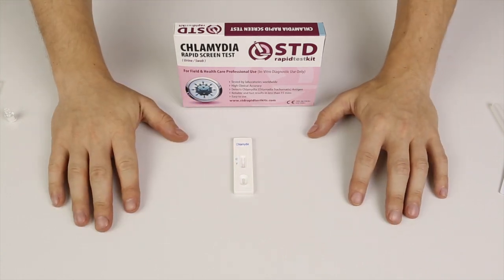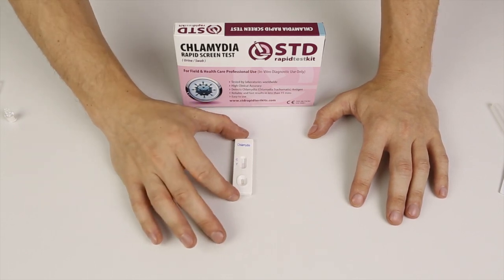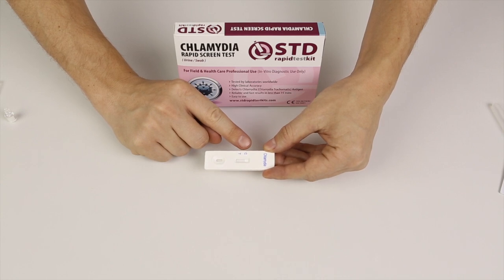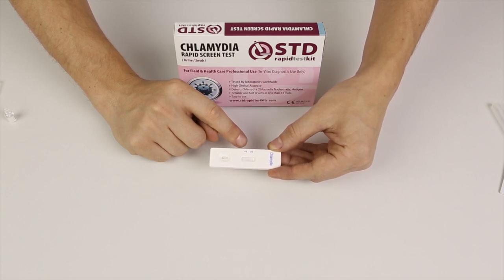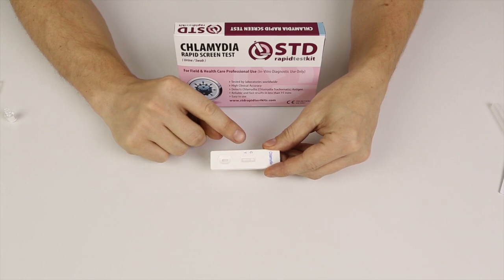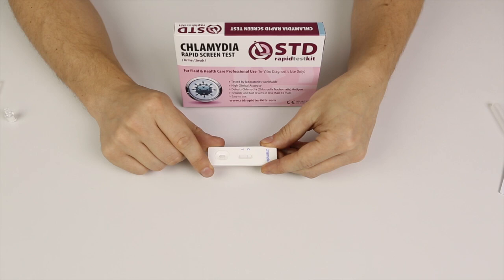Now we have to wait about 10 minutes before the results show up. In the meanwhile, I'll explain what the different parts of the cassette are. That's the C — the control line. One line shows up next to the C — that's good news, that means the test works. If I were to test positive for chlamydia, then two lines would show up: one next to the T on your right side, and one next to the C. So we'll wait a little bit and see how it goes.